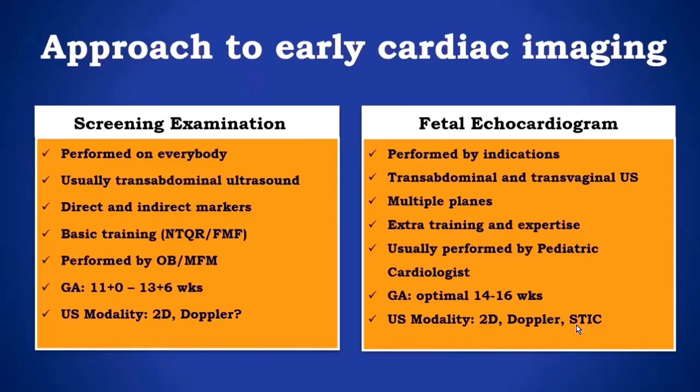qualifications or certifications, such as through NTQR or the FMF. Basically, this is the exam that is performed in doctors' offices, like regular OB offices, but can be done in the MFM settings. The examination is performed between 11 weeks 0 days and 13 weeks gestation, generally speaking, but the best window for doing the cardiac screening examination is indeed between 12 weeks 0 days and 13 weeks 6 days.